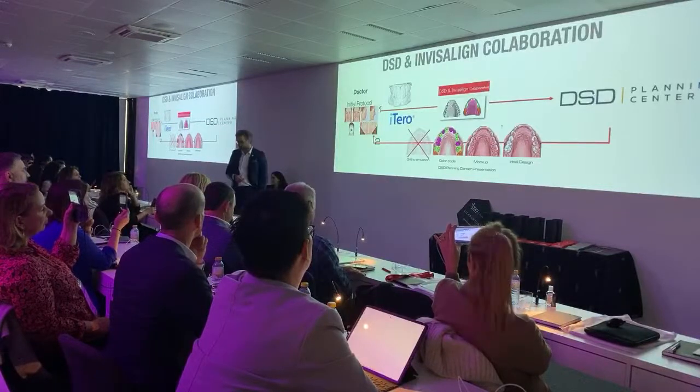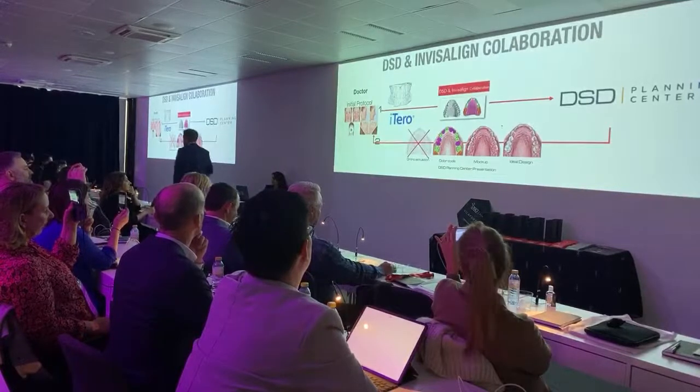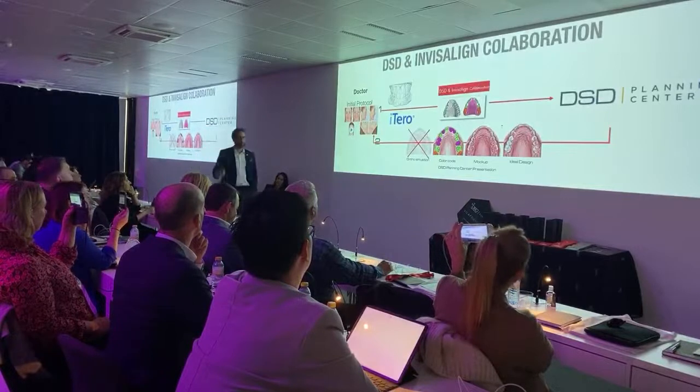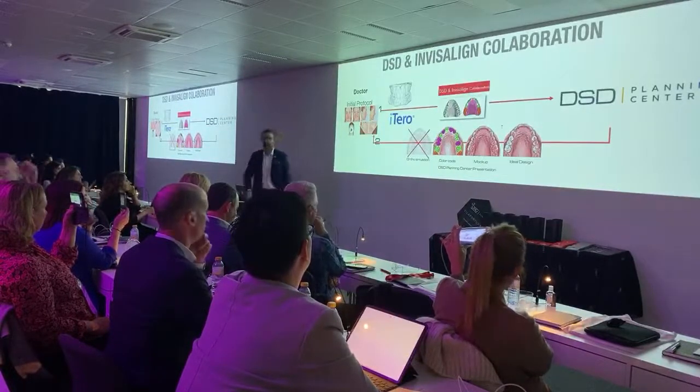Okay? So, anyway, we send the new design thinking on ortho. We send the motivational design for you to do the mock-up. We send everything. You still have the color code. You evaluate that. You ask for changes, or you accept. You do the mock-up the same way. Okay?